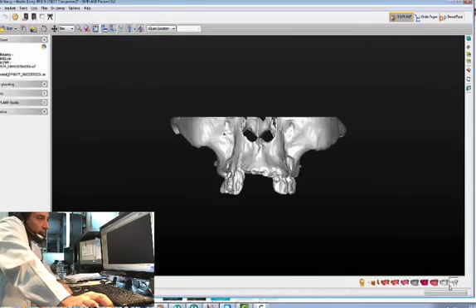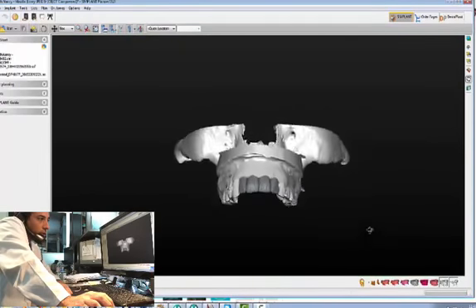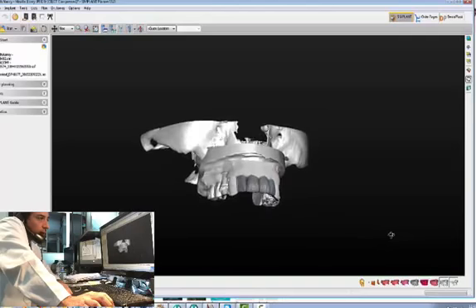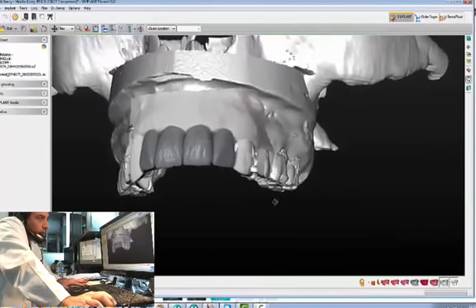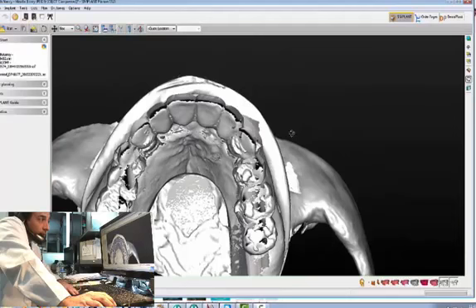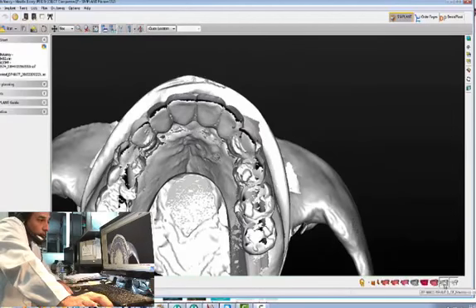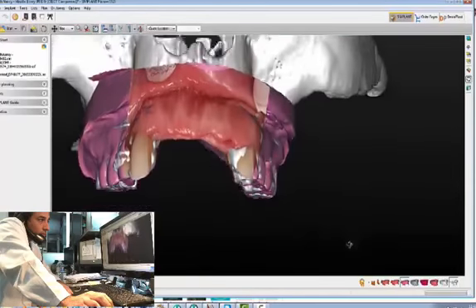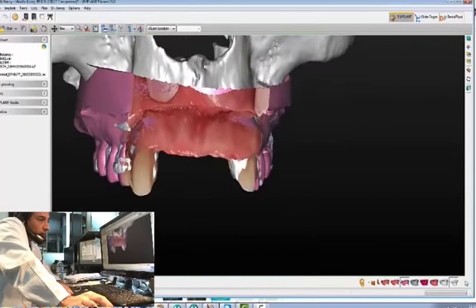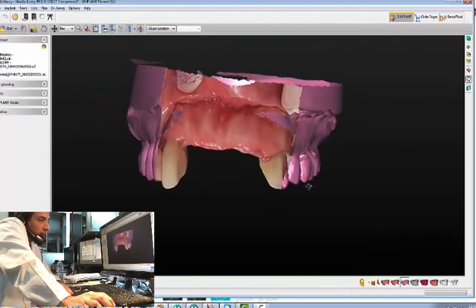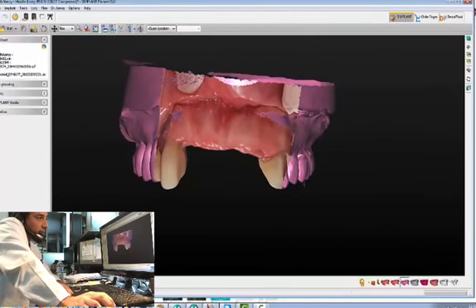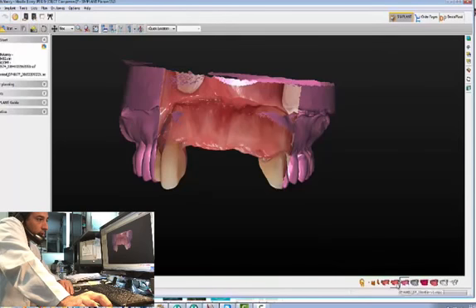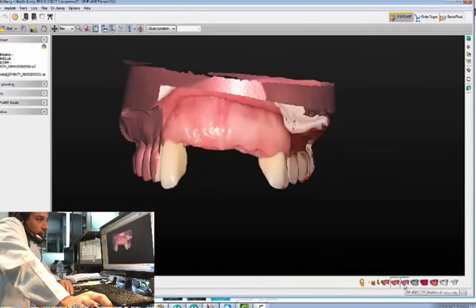Once we have the CT scan and the model stitched on top, we can now plan the position of the implants where we want them, and where it is doable. I also merged a photograph right here — we don't have to look at the bone at all, but this is basically a photograph that is merged on top of the model of the dentureless ridge. And I have it from different angles.